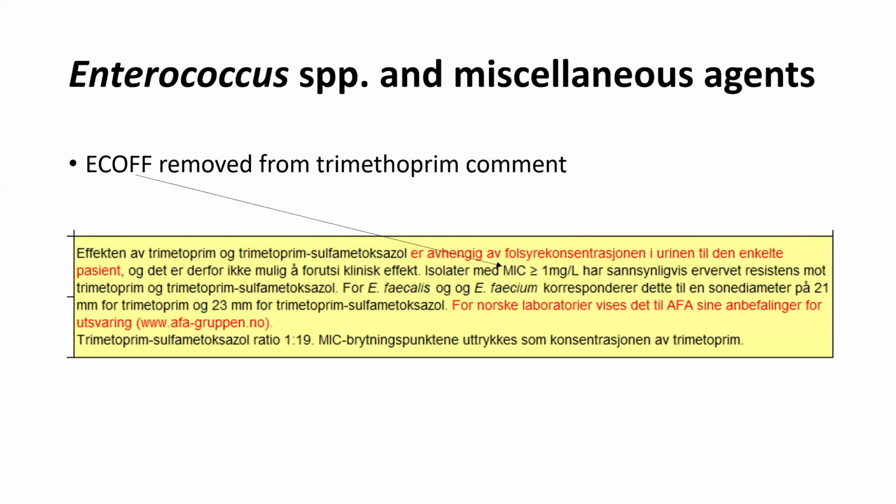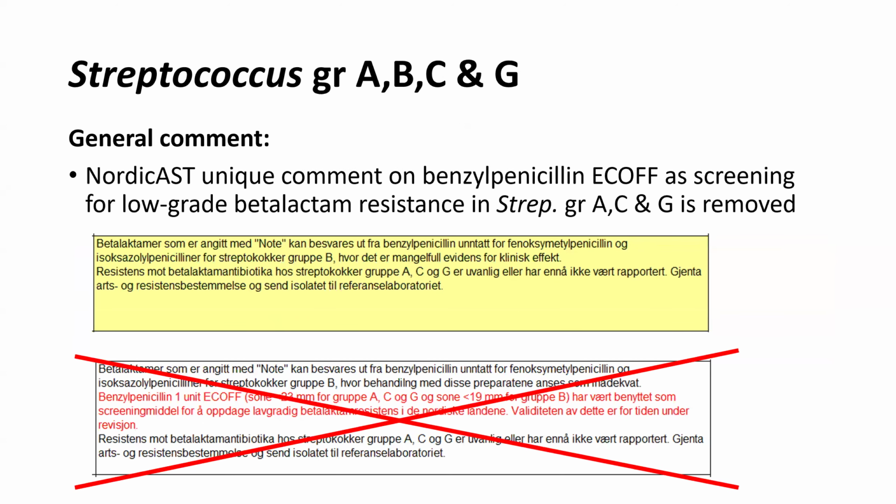And then it's the enterococci and the trimethoprim and trimethoprim-sulfamethoxazole, where we have a specific comment. And now it looks like it's all yellow, but the only thing that's changed is that we no longer have the ECOFF as part of the wording. So otherwise, everything else is just like it used to be. So there's really nothing important changed here. Then we're done with the enterococci.